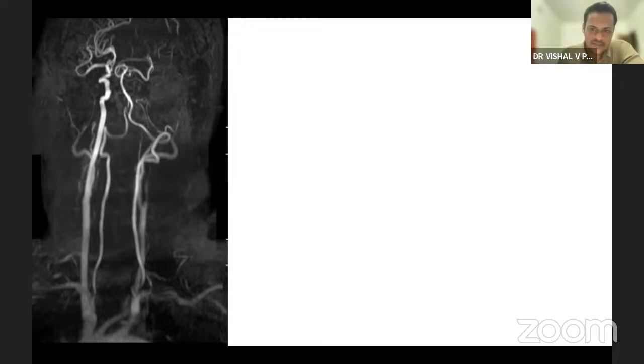Supposing you're going with a distal T occlusion, then you're going to say, okay, I'm going to take a Neuron Max or whatever distal. I'm just going to take React and a large bore system. I might use a stent retriever to track it up, but I'm just going to aspirate the whole thing and come back. Okay. But if you're dealing with a chronic lesion like carotid, then you're going to say, okay, this is going to be difficult.